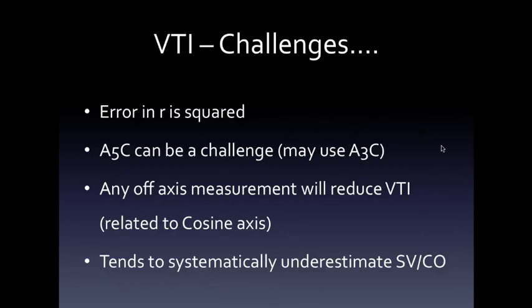And that's before you take into account that, of course, the stroke volume is going to vary with filling. And, of course, filling will vary on loading conditions, and loading conditions will vary on ventilation, positive pressure, all the issues that go on in the sick patient. So a lot of these were validated in healthy people in a core physiology lab, and unfortunately a lot of these assumptions fall down in the sick patient, which is the patient we're interested in by and large.